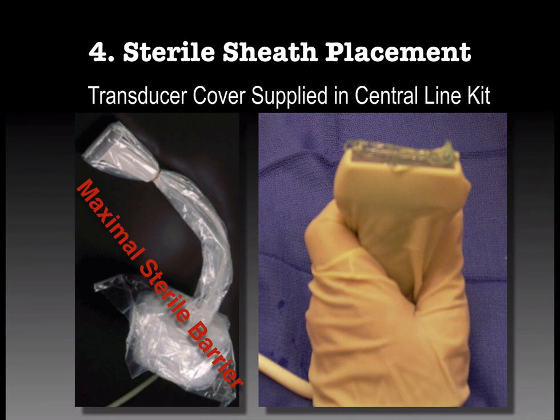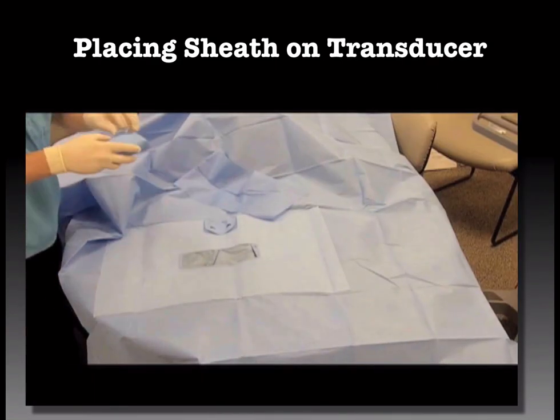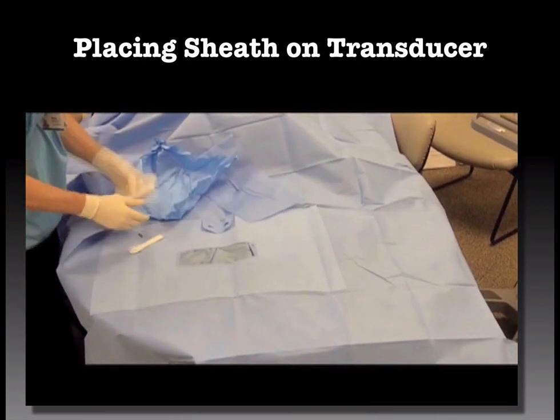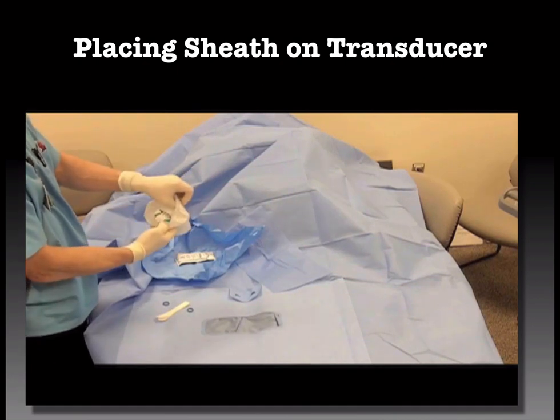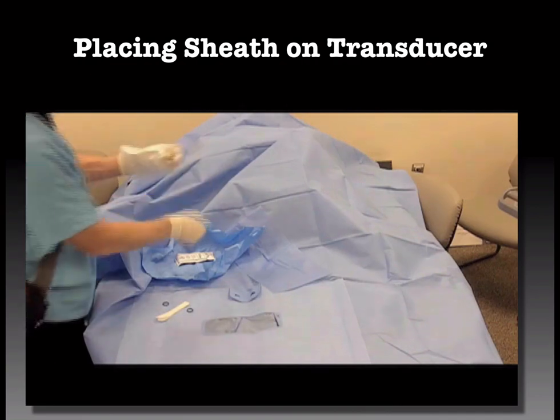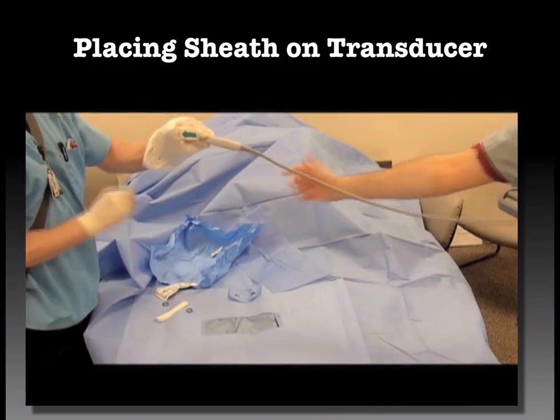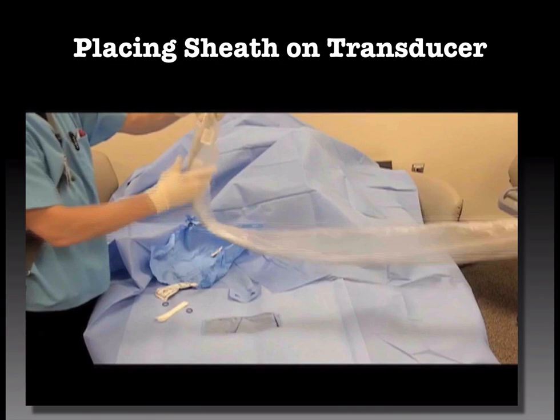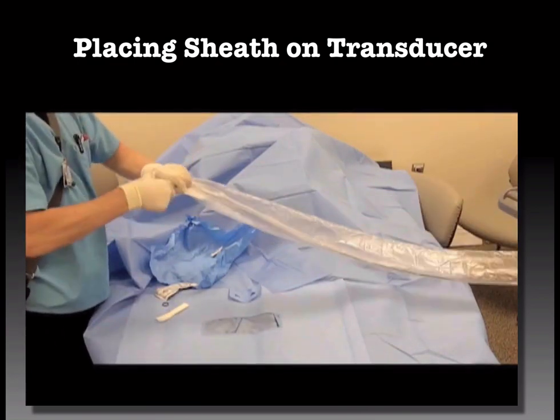Now, placing this in a sterile field can be a little bit of a challenge. What you want to do is establish your sterile field, place your sterile transducer cover in the sterile field, and use gel inside the cover. That gel has to be against the transducer. Then you can use your observer to hand you the transducer so that you are not contaminating the sheath. Have your assistant pull the transducer cover tight.